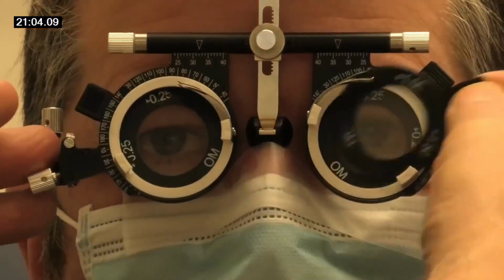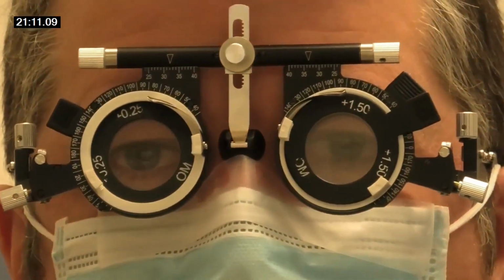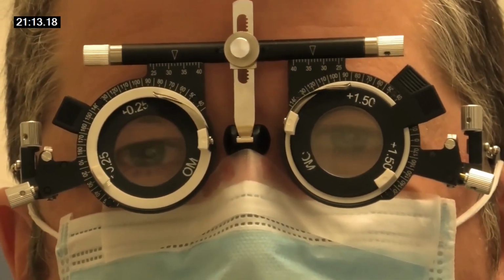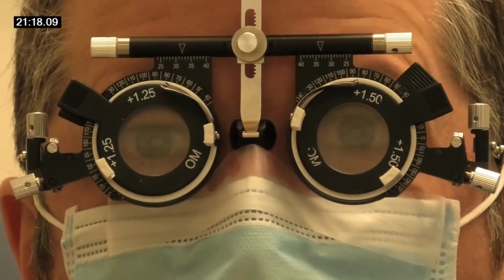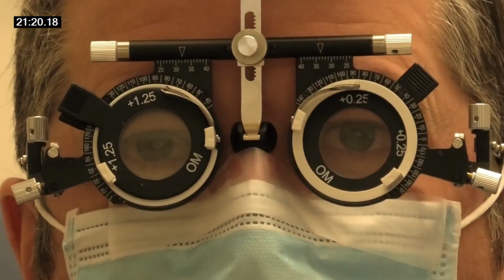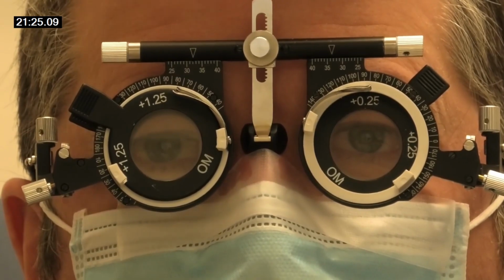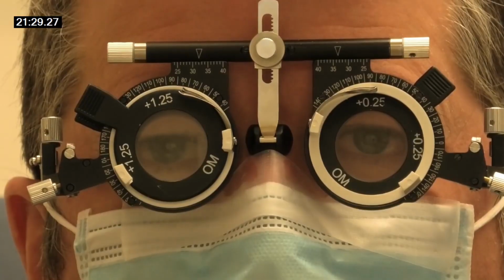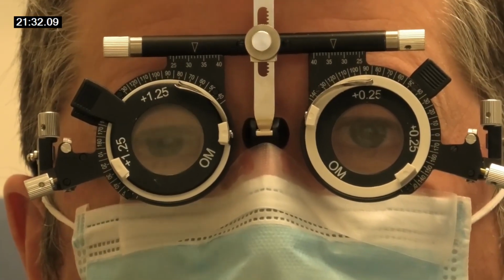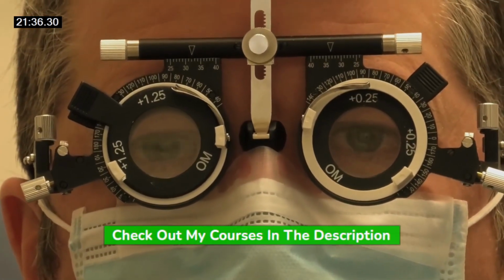What you could do, I'll show you another trick, is you get one of these, let's say you're going to have this one, to blur that eye up. I'll clean the smudge off it. So if we put that one in, is that a bit blurred? Yeah. And then can you see a bit better now? Yes. So I put that lens in and asked if it's blurred. He said yes, it's blurred. We've taken that one out, and he says it's clear. So by him saying yes twice, we know that we've blurred this one up and we're on this side. Yeah.